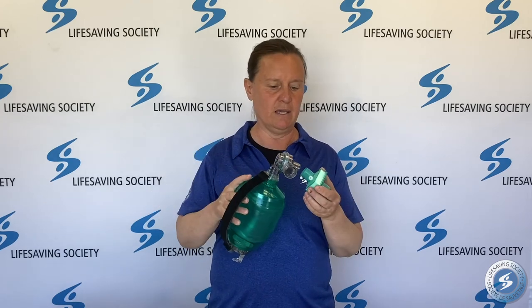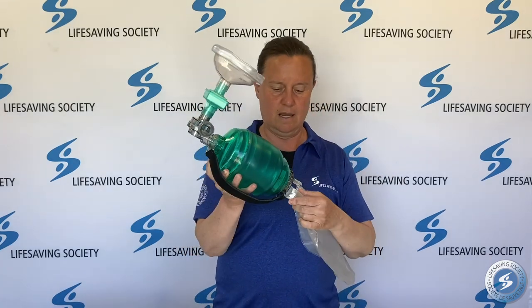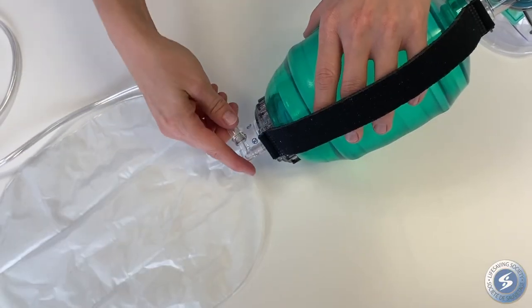When putting your bag valve mask together, you will need your bag, your viral filter, your mask, and your oxygen reservoir bag with the tubing.